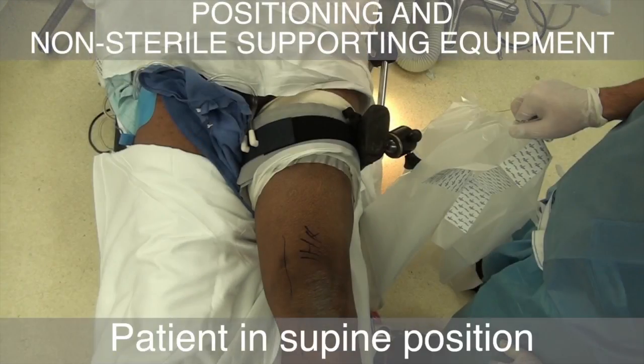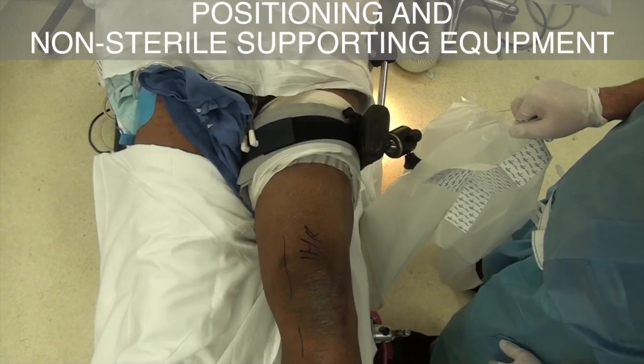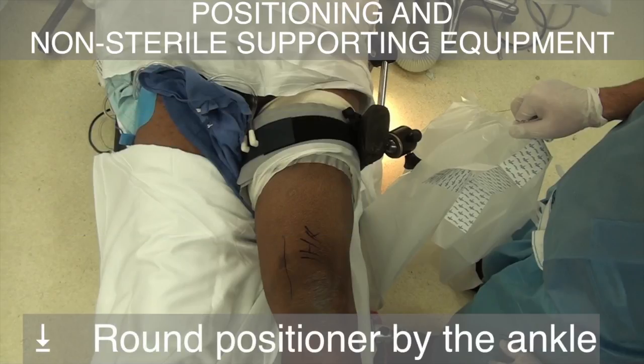The patient is placed in the supine position. The tourniquet is well padded and placed on the thigh as high as possible. A rectangle positioner is placed on the lateral side of the thigh, allowing maintenance of the vertical position of the thigh when the knee is flexed. A small round positioner is placed at the ankle of the non-operated extremity.